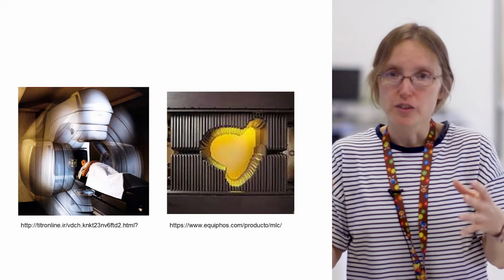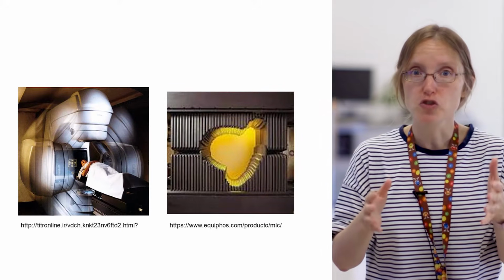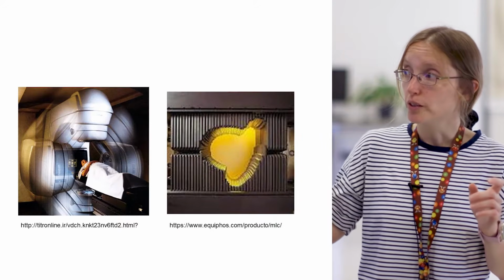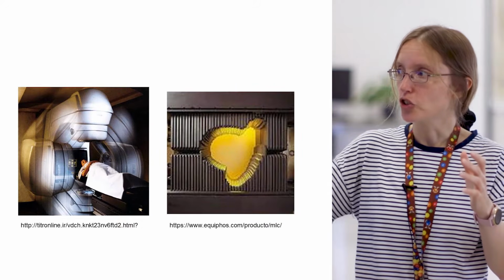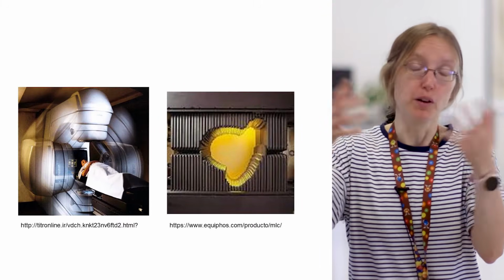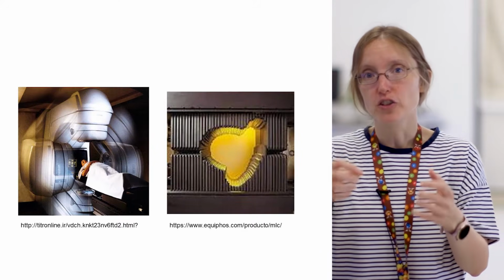Also, to try and protect the normal tissues and make sure the radiotherapy is going exactly where we want it, we shape each radiotherapy beam. That's achieved by virtue of leaves of tungsten, shown on the right-hand picture, which are in the head of the machine. Effectively these are like shutters, and they can move in and out and create an aperture.